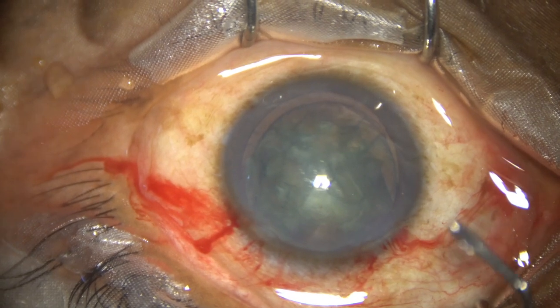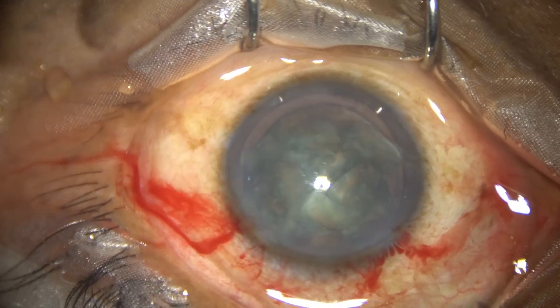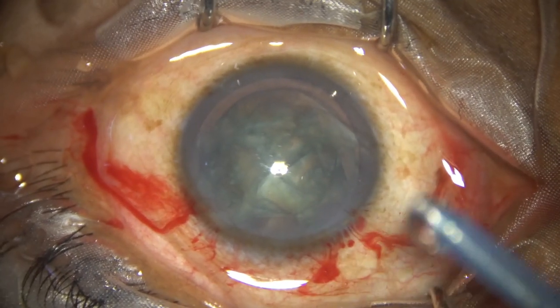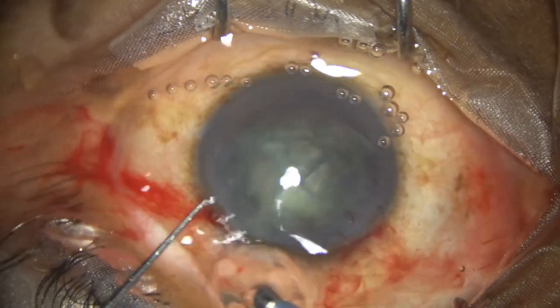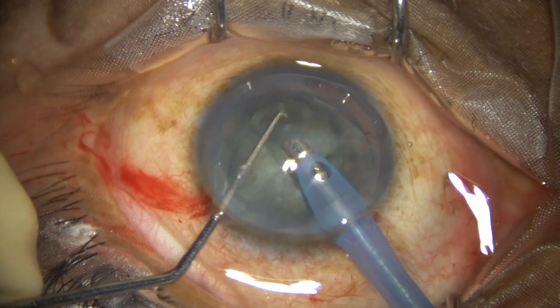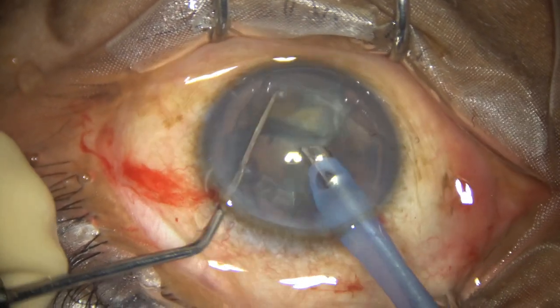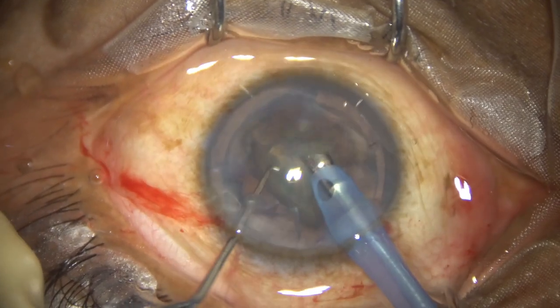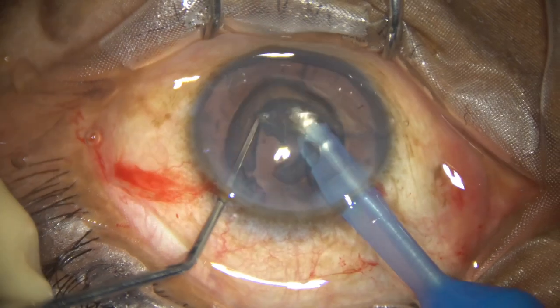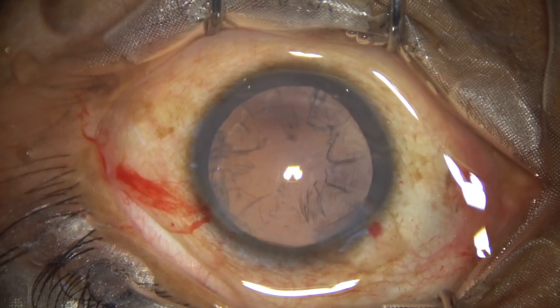Now the job of the phaco handpiece is just to remove the pieces. The machine being used is the Oatley Cataract 3. The phaco handpiece goes into the anterior chamber, and immediately after aspirating some superficial lens matter, the nuclear pieces are caught by the tip of the phaco needle and emulsified. Ultrasonic energy used is very low — about 40% — flow rate is 40, and vacuum is 400 mmHg.